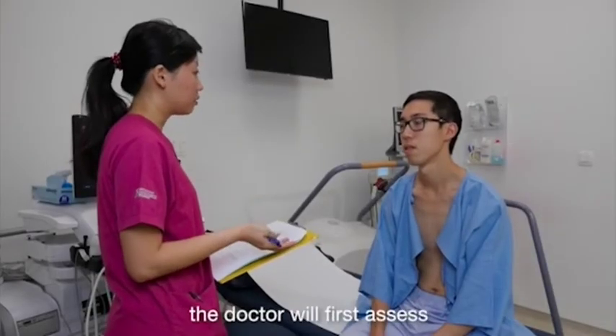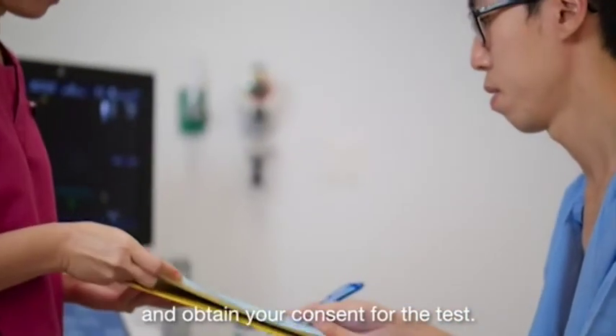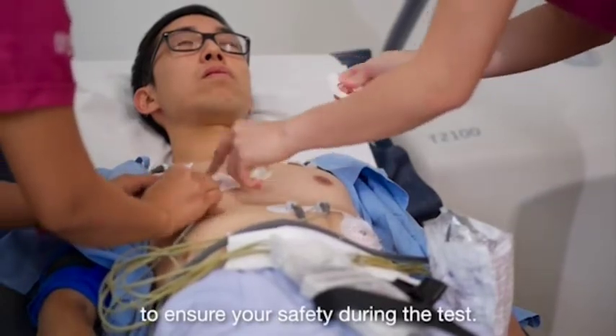Before the test, the doctor will first assess if you are medically fit for the test and obtain your consent. As the test involves stressing the heart under controlled conditions, doctors will also take precautions to ensure your safety during the test.